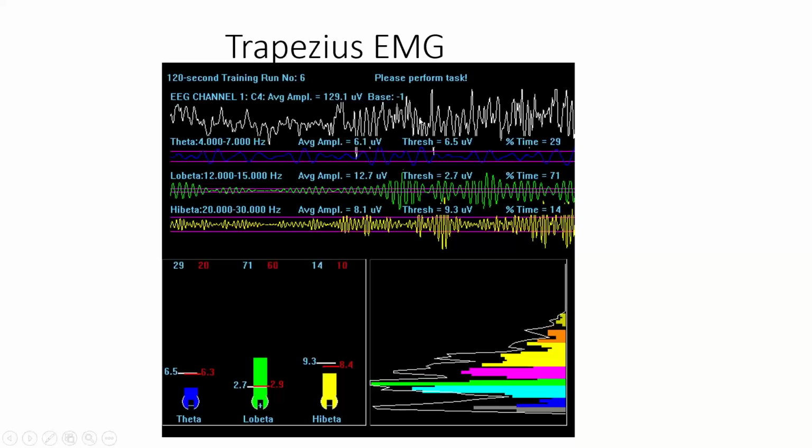And you see it's not quite as tight, right? And not as spiky as maybe jaw tension would be, or temporalis muscle. And you can see here, well, the peak looks like it's in the low beta range at this point. So that's a subharmonic, right? It's a subharmonic.